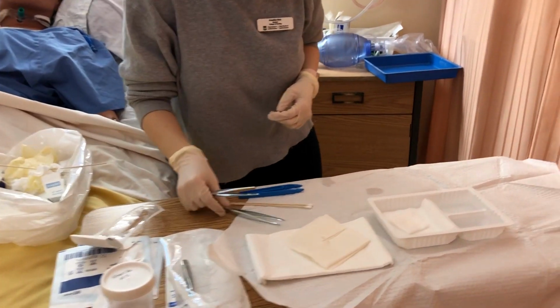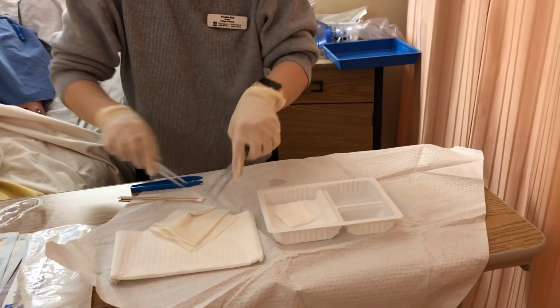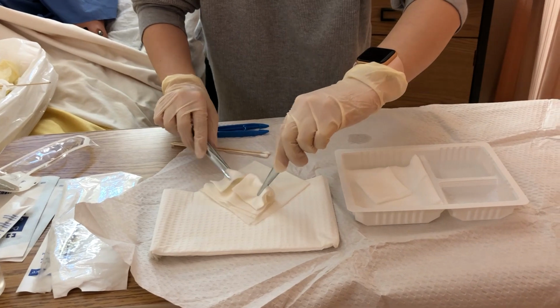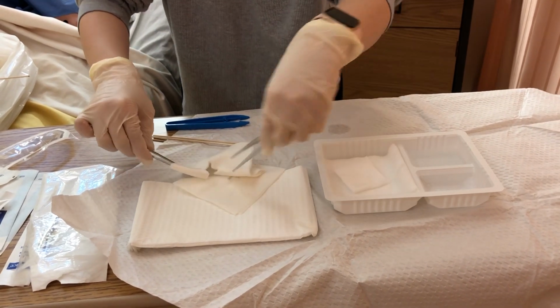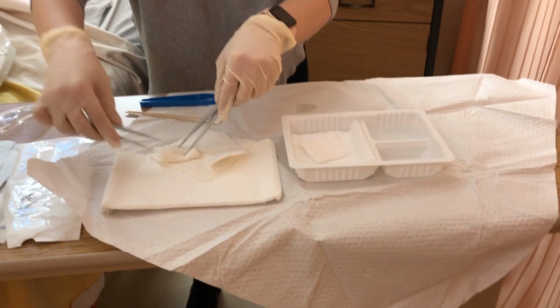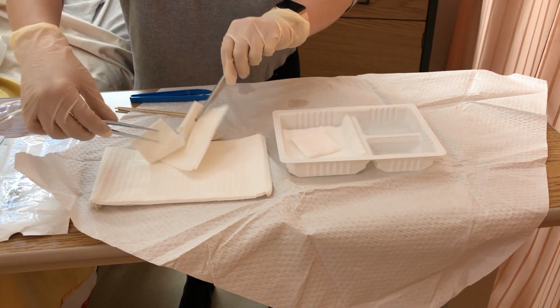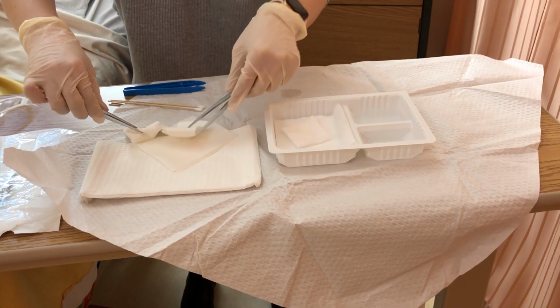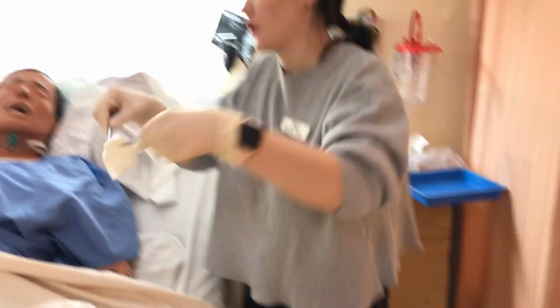Okay. So now that it's dry, I'm ready to put the new dressing. I'm just going to try to fold it into a little, making sure that I keep the center part sterile.